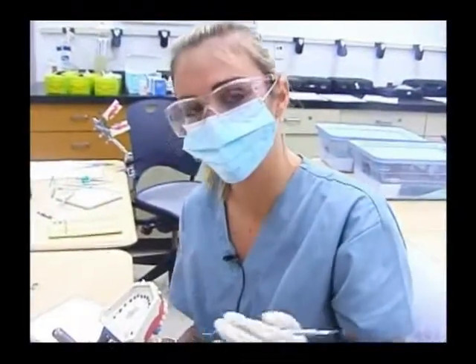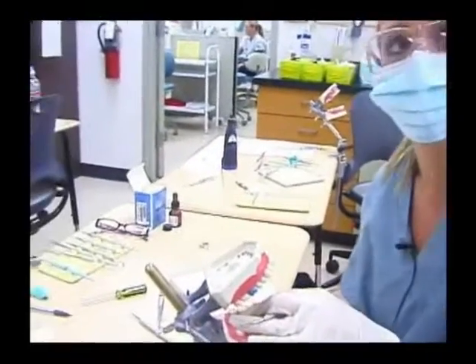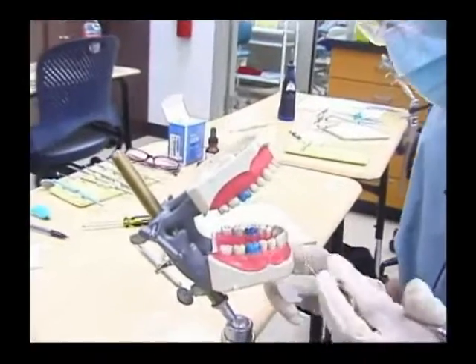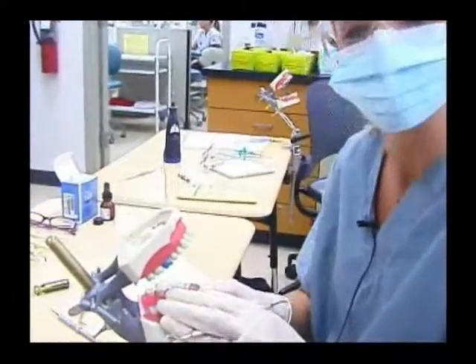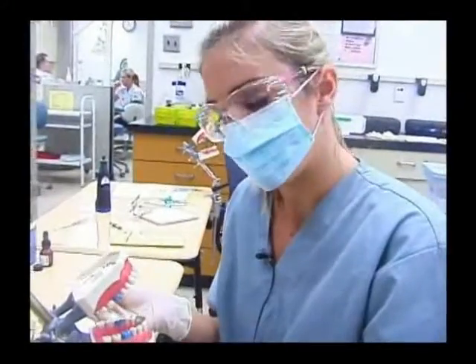So what we're doing today in class is a temporary sedative dressing. What it is is a temporary filling. If a doctor is out of the office and a patient comes in with a broken filling, we are able to fill it with a temporary sedative dressing. The temporary sedative dressing consists of IRM, which is just a temporary base.